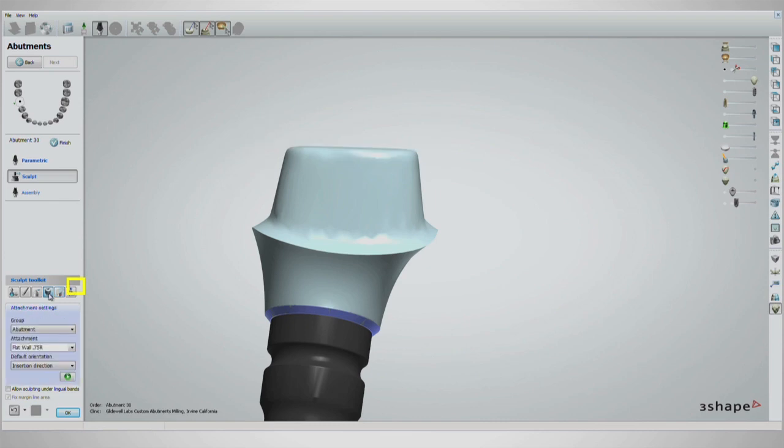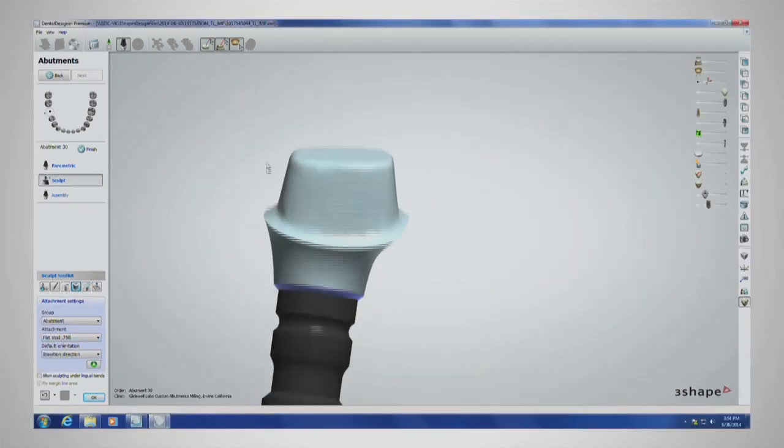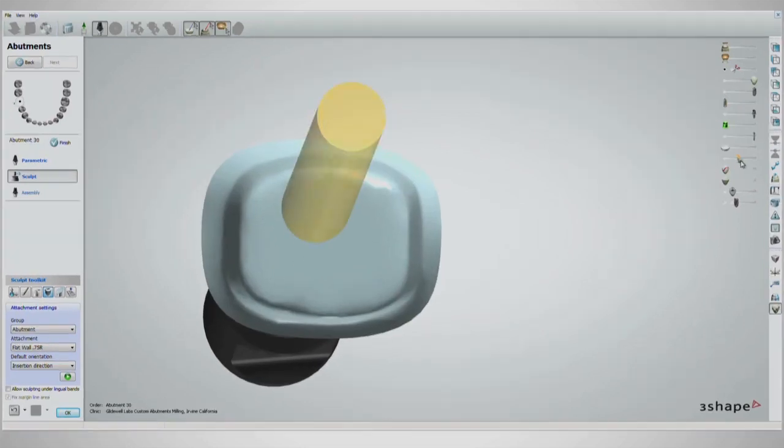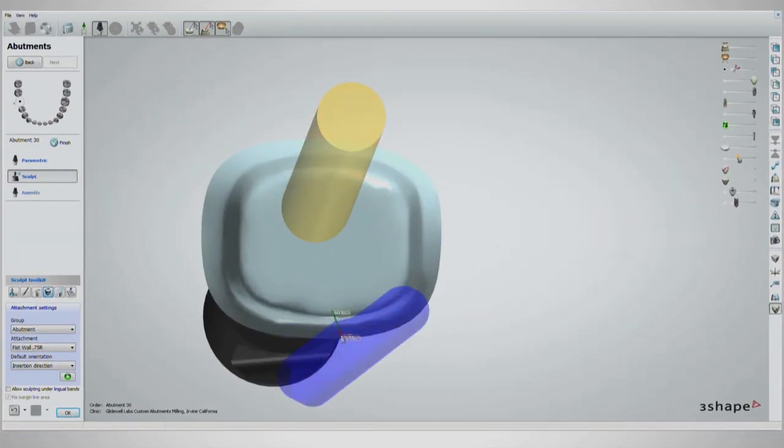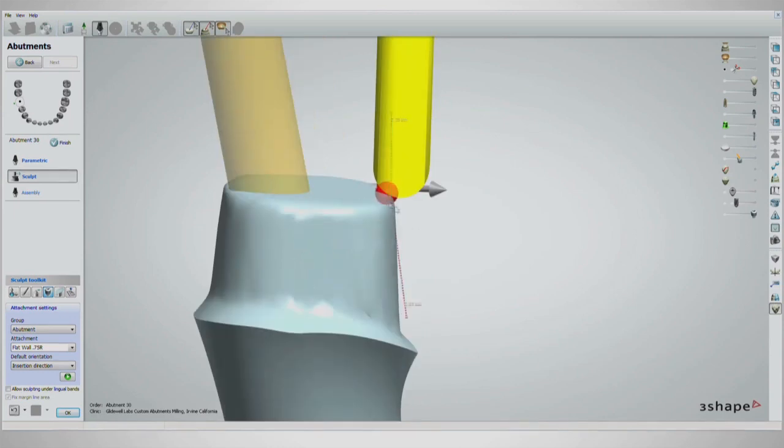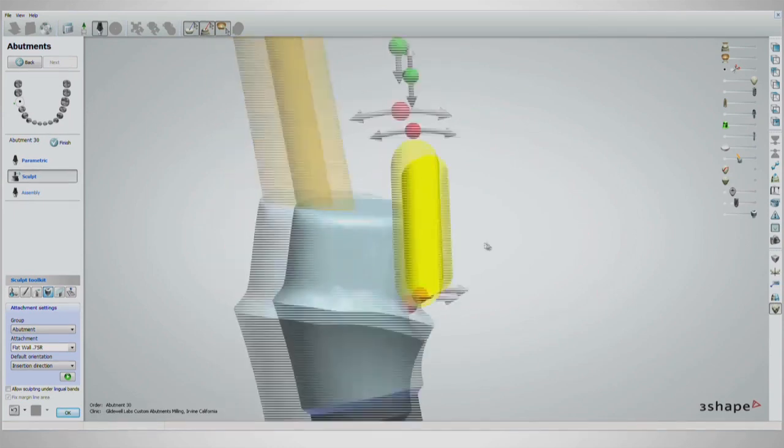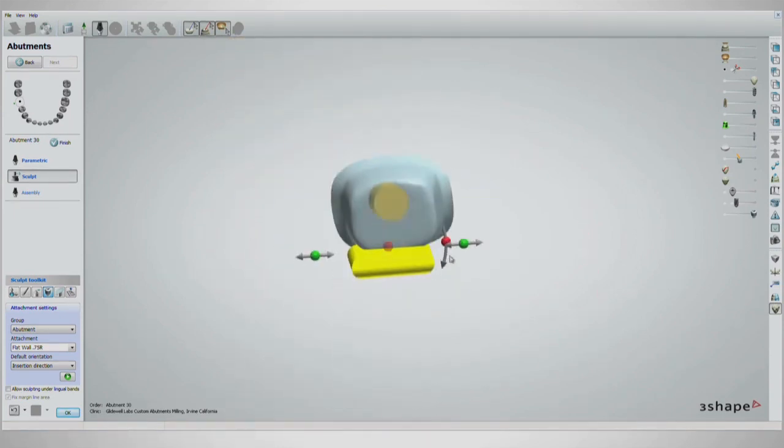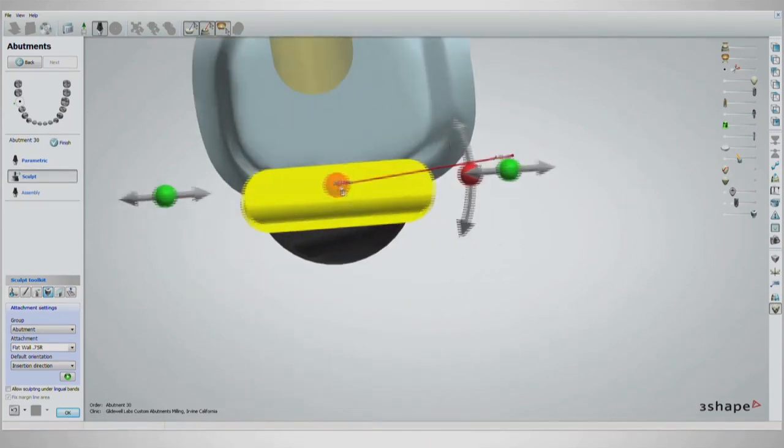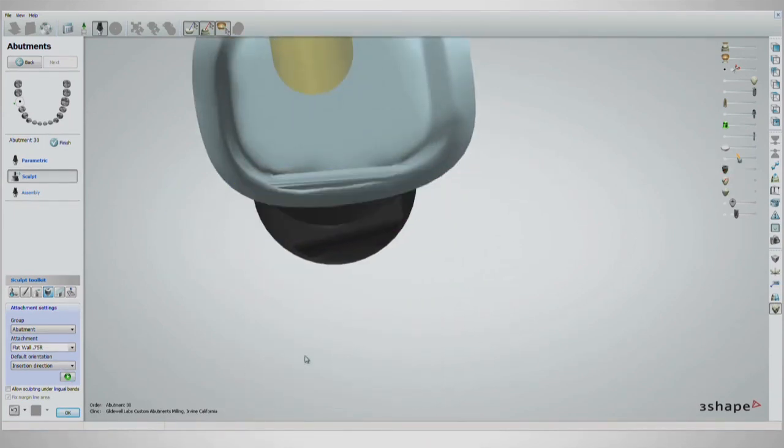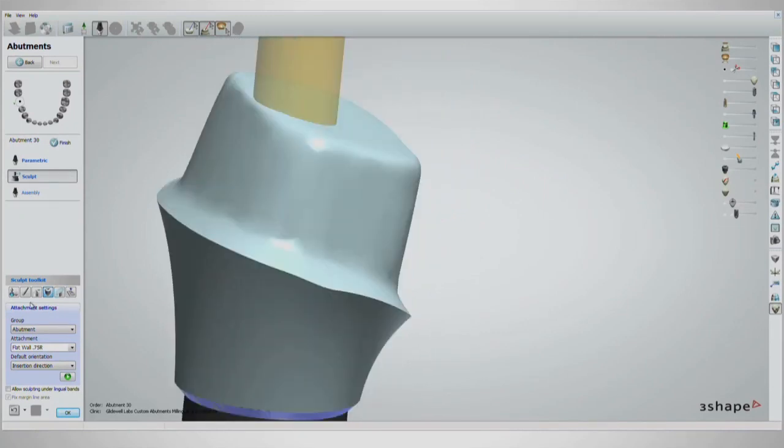With the abutment flat wall tool set at three-quarter millimeter radius, you can manipulate the tool to clear away part of the abutment and act as an anti-rotational flat wall. After that is done, smooth out the rough areas on the shoulder.